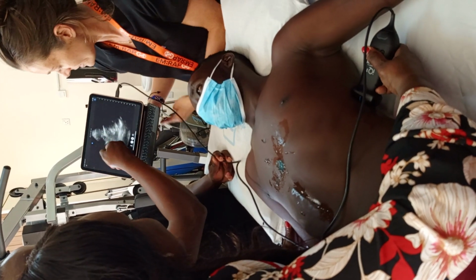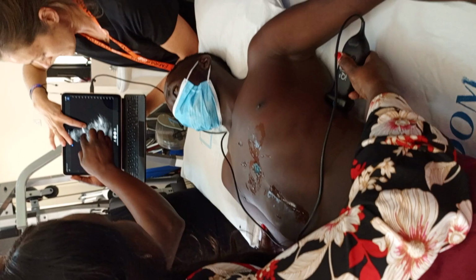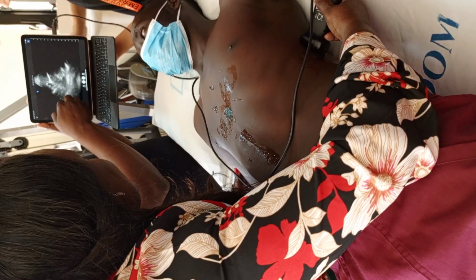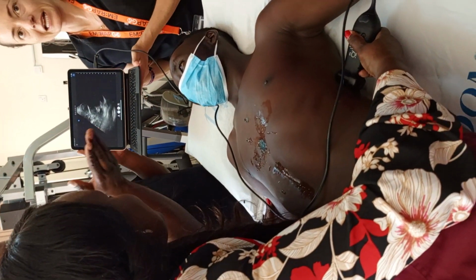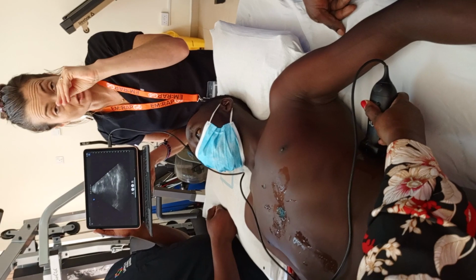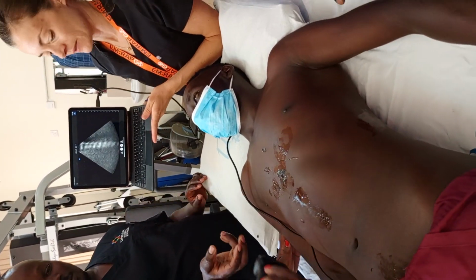Okay, there you go. All right, so what's this? This is a spleen. And what's this? It's a kidney. And what's this white line? Splenic renal space. It's a potential space, and we just see it as bright white because it's the two organs touching. We want to see bright white. Okay, and then we'll go to your suprapubic view.